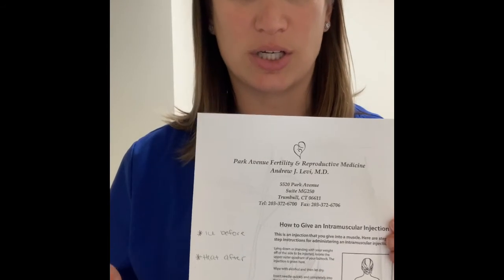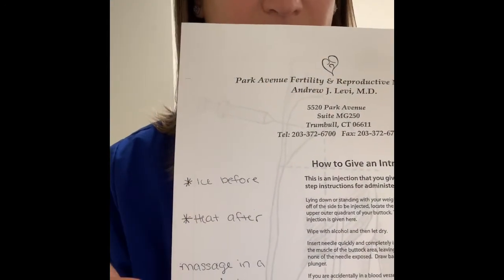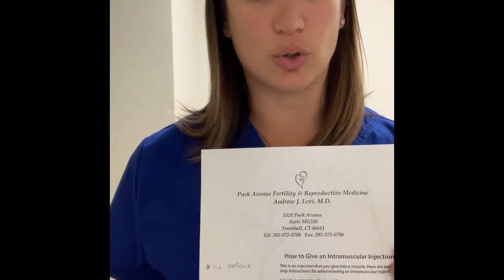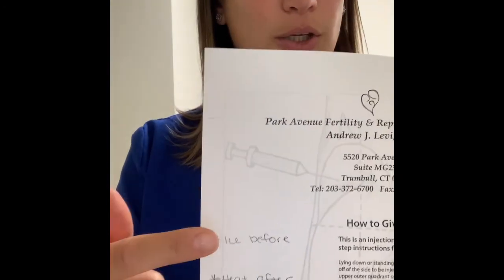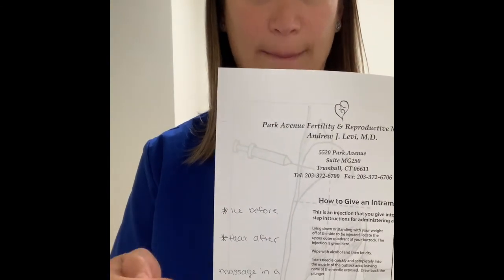What's really going to help you in the long run after each injection is heat and massage. After you've done pressure with the gauze for a minute or two, use a warm wet washcloth or a heating pad on that area and massage in a circle for about five minutes. That will help the medicine disperse — otherwise you'll end up with balls of oil under your skin. You can ice beforehand if you want to, but do not ice afterwards, because the oil will congeal under your skin. Ice before, heat and massage after.